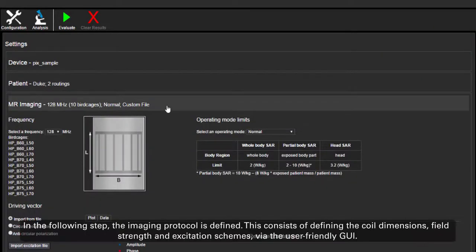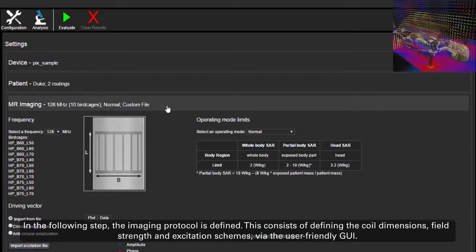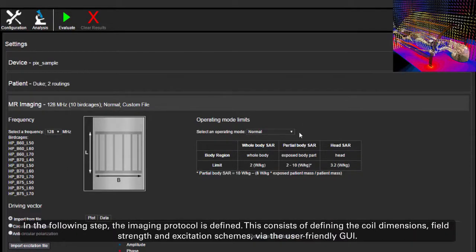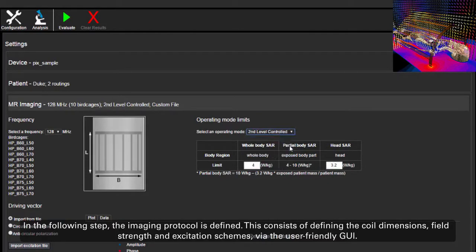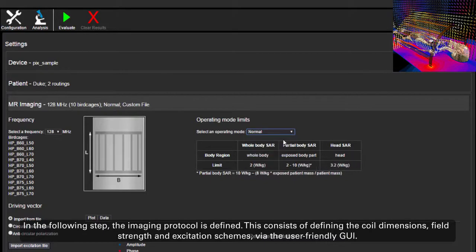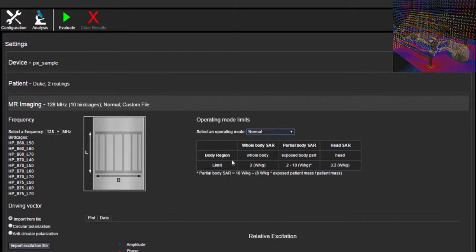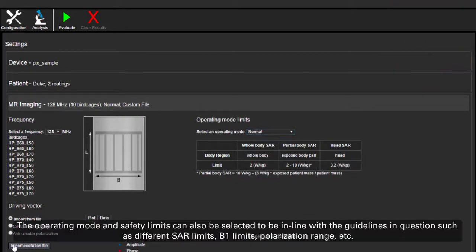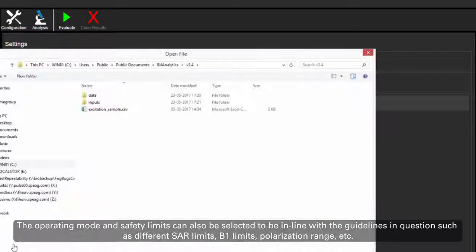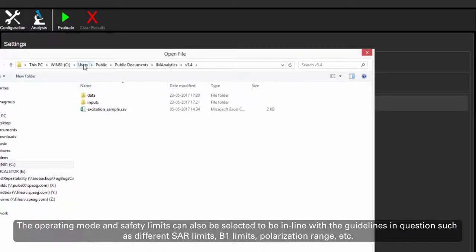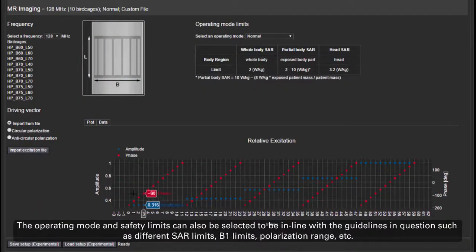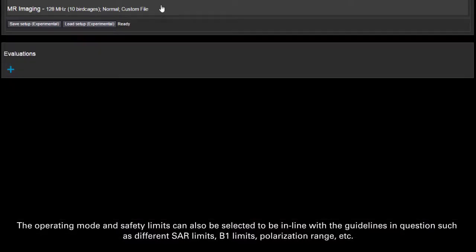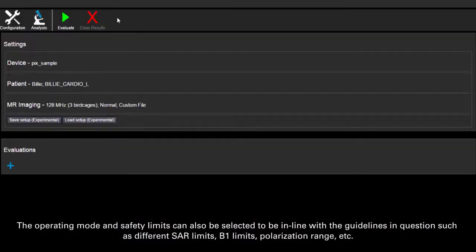In the following step, the imaging protocol is defined. This consists of defining the coil dimensions, field strength and excitation schemes via the user-friendly graphical user interface. The operating mode and safety limits can also be selected to be in line with the guidelines in question, such as different SAR limits, B1 limits, polarization range, etc.